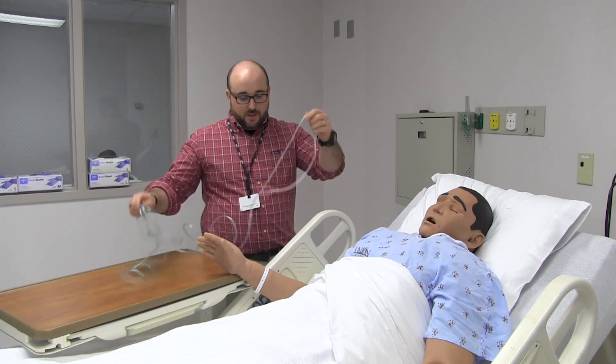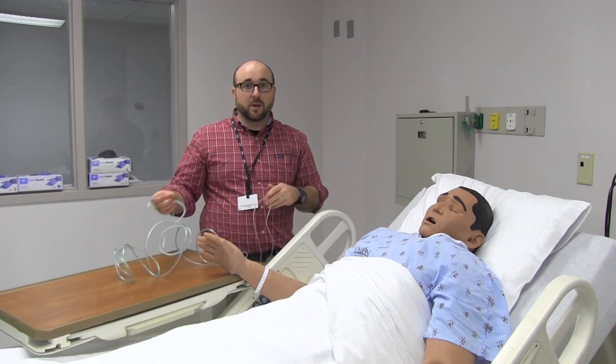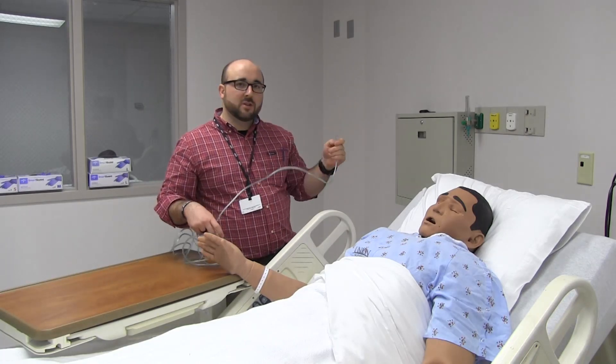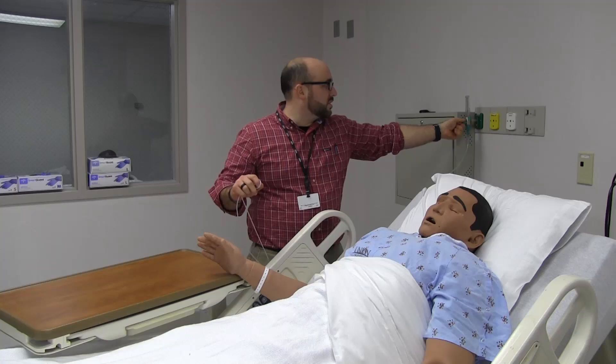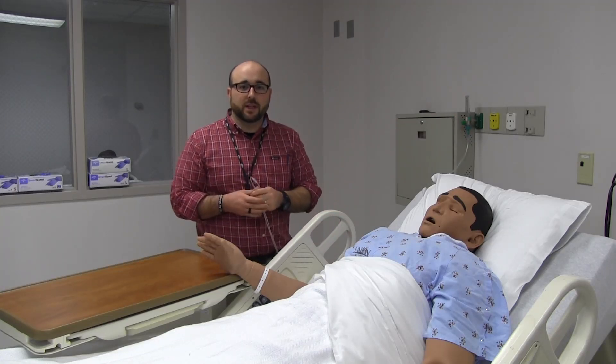So, standard cannula. First, it will plug into the flow meter — that's fairly simple. You have to have a Christmas tree adapter, as we've shown before. Plugs in right here. I always start the oxygen flow, turn the knob counterclockwise. Let's go with 3 liters here — the ball is right in the middle of 3 liters.